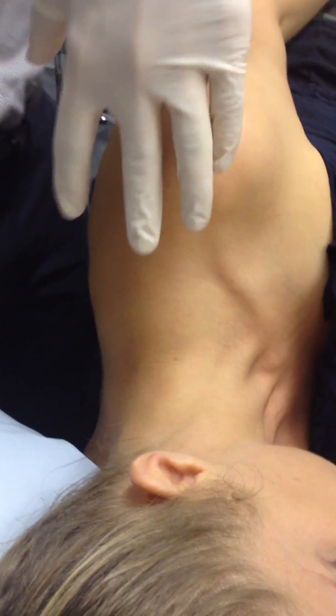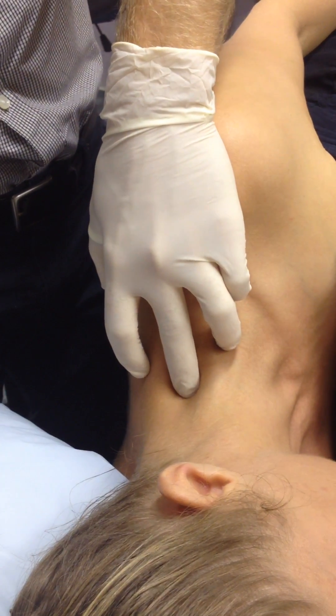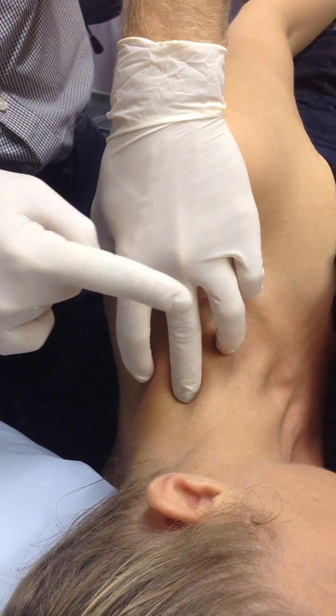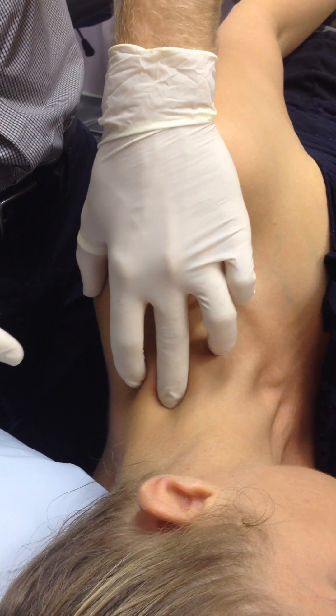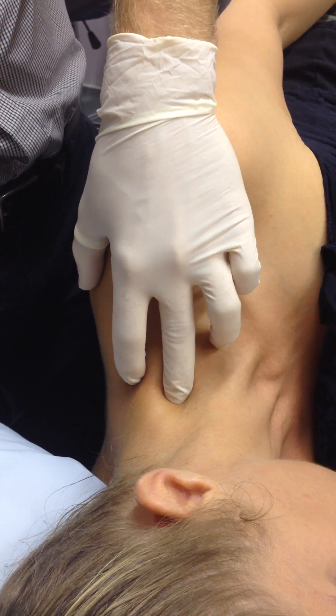Then what we can do is a pressure going straight towards the floor. Basically what you do is keep that pressure going straight towards the floor, then you just move your hand anteriorly until you flick over — and you can see that there, flicking over — which we've called the plop.